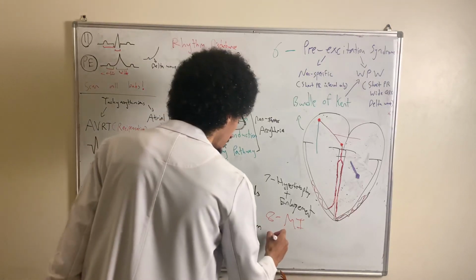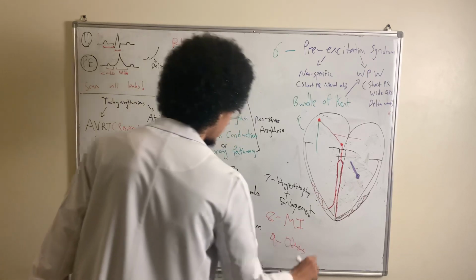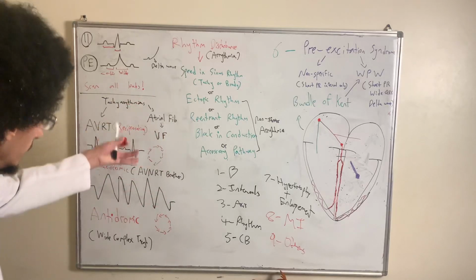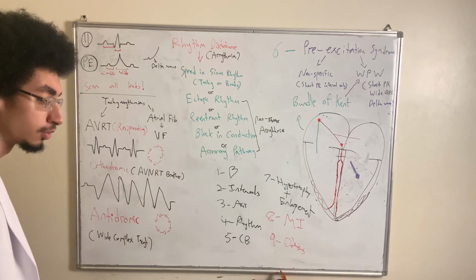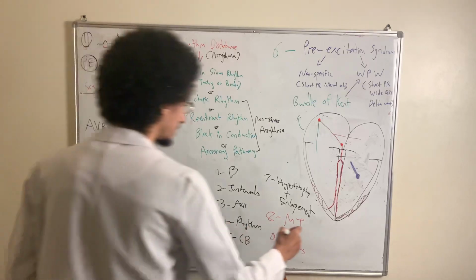And then we'll have step number 9, which are others. We'll assess for other conditions that can cause changes in the EKG, like pulmonary embolism, like pericarditis, for example, like hyperkalemia, hypokalemia, and so forth. Step number 8 and 9 is according to the case.